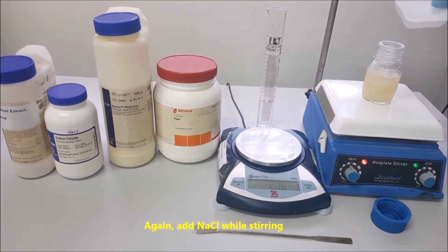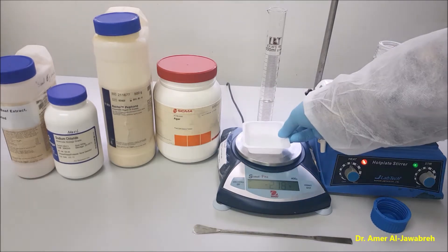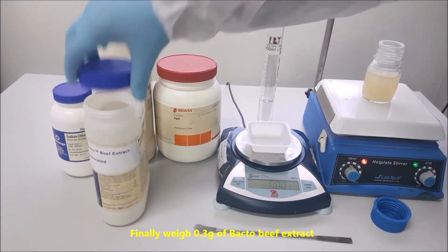Add NaCl while stirring. Finally, weigh 0.3 gram of bacterio beef extract.